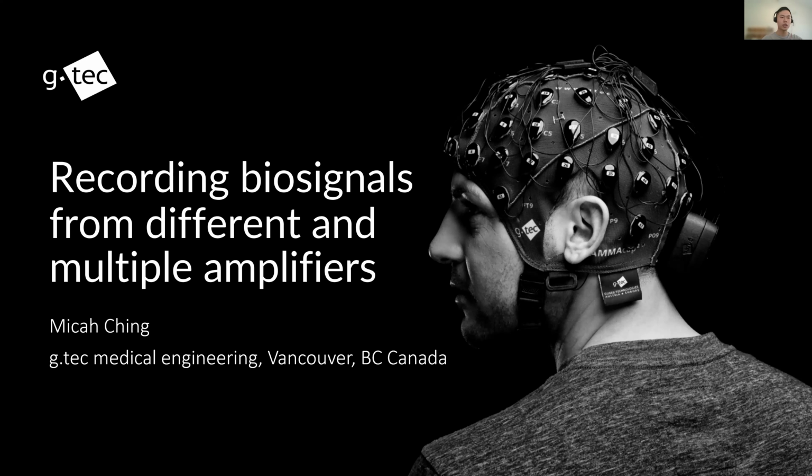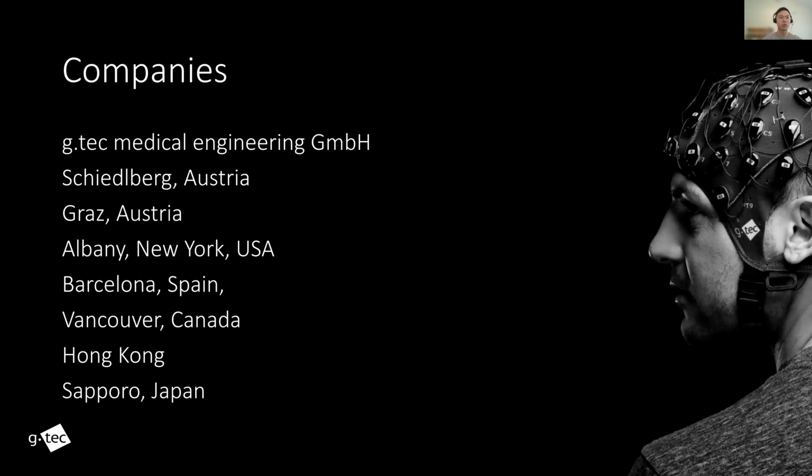Right, yeah. So we'll share how to do biosignal with multiple amplifiers and different types of sensors. It's a more practical session for this hour.